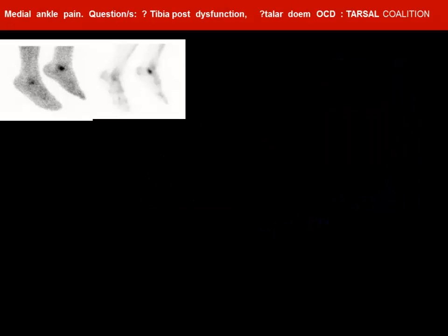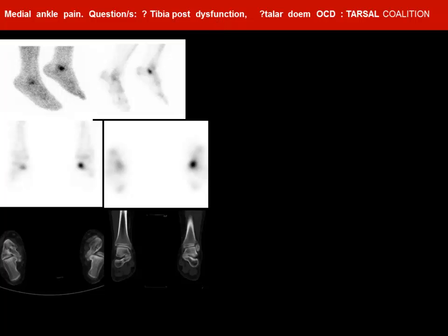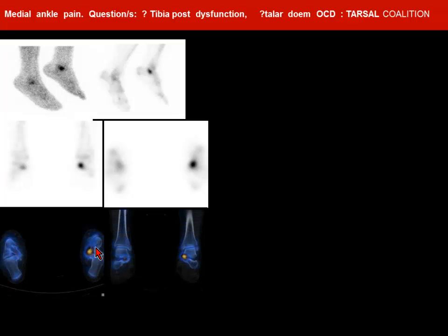Patient with medial ankle pain — the question was posterior tibial dysfunction. Interestingly, you can see tarsal coalition here. This can be diagnosed on a plain X-ray, but the clinical question is usually whether it is metabolically active, or which side of the ankle joint is metabolically active. In this case the focal uptake is more on the left side. Though there is bilateral tarsal coalition, the uptake is greater on the symptomatic side. In fact, if you perform an ankle SPECT-CT, you find tarsal coalition in at least half the patients scanned — unless you look for it, you will not find it, and most are asymptomatic until they become symptomatic and need to be managed appropriately.